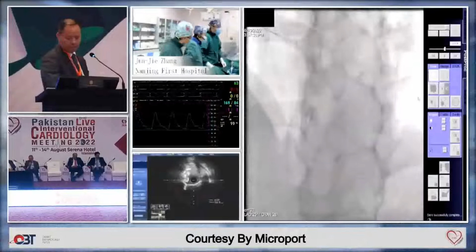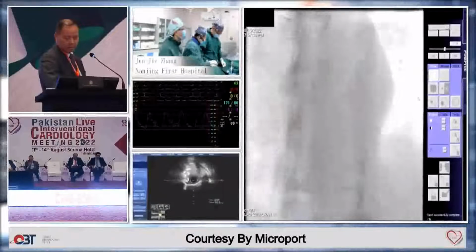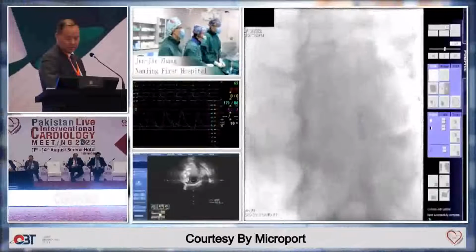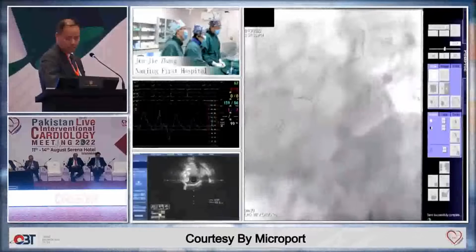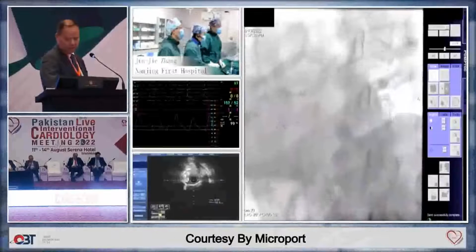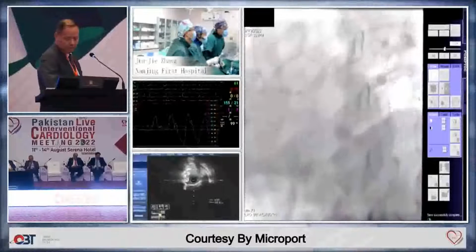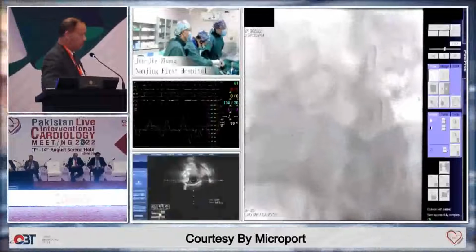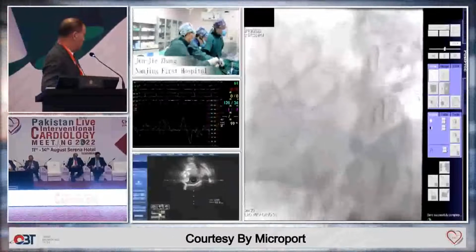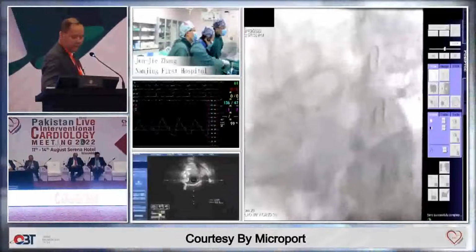Thank you, Prof. Thank you for your time. So I put the circumflex wire into the aorta, avoiding the guiding injuries. But this is very important. Just prepare on time.